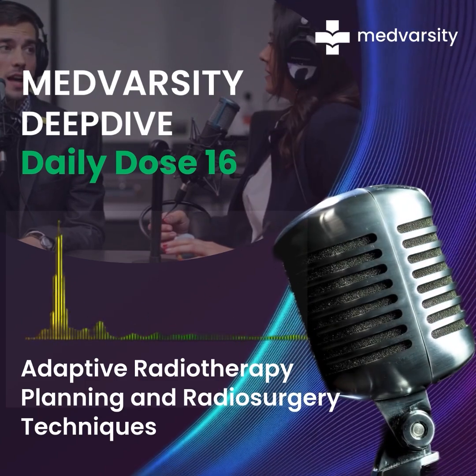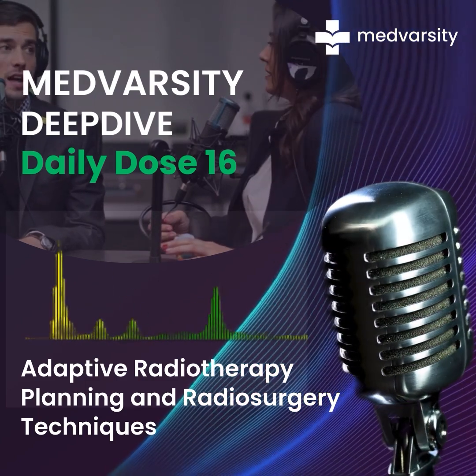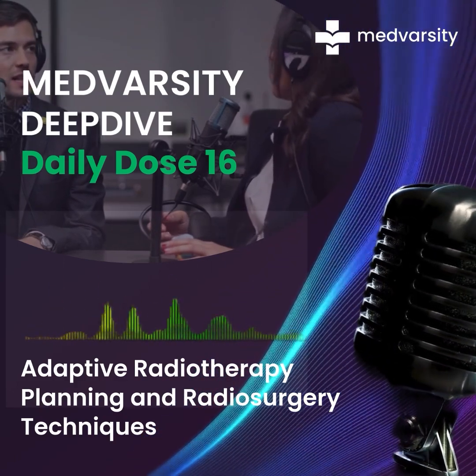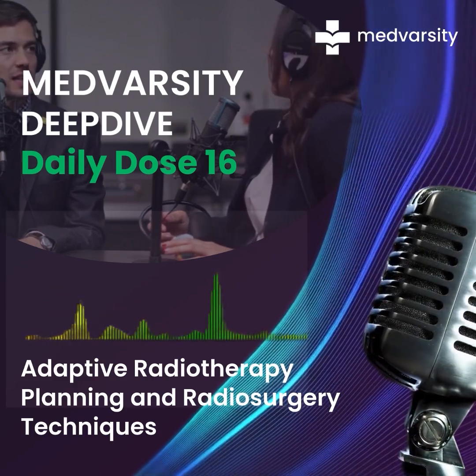That's wild. I remember reading something about this with head and neck cancer treatment, specifically about how it protects the parotid glands, the salivary glands near the ears. Absolutely. That's a perfect example of how we can minimize side effects using this type of radiotherapy.